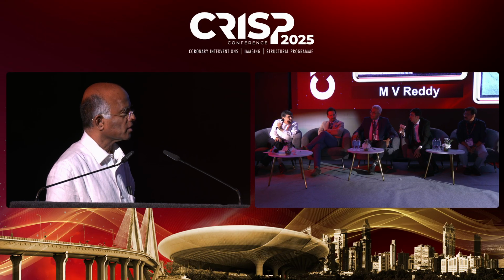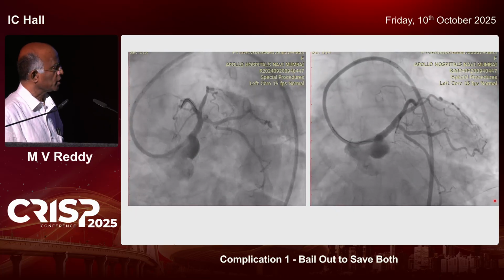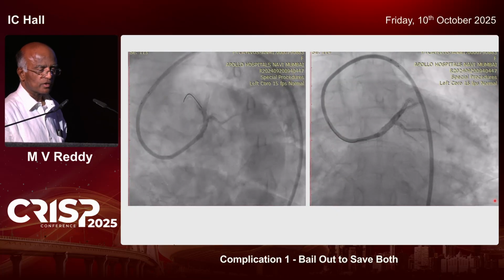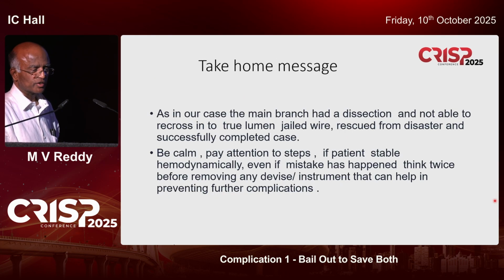Post dilatation was completed with high pressure, then also you will not be able to. Then the next steps would be DK crush, and this is the final result. The patient went home without hemorrhage.